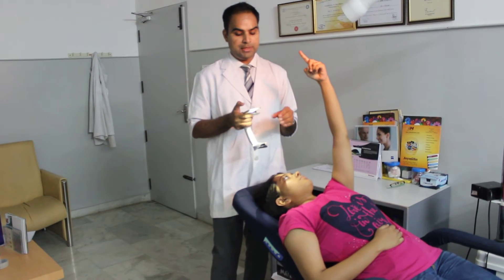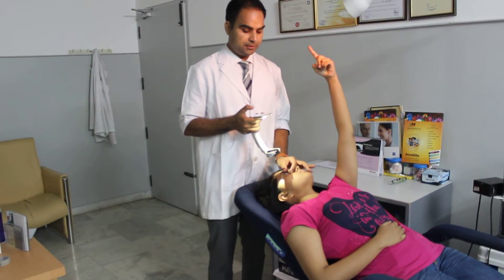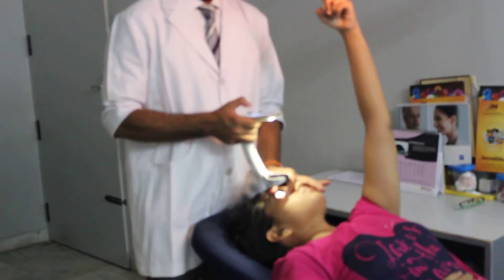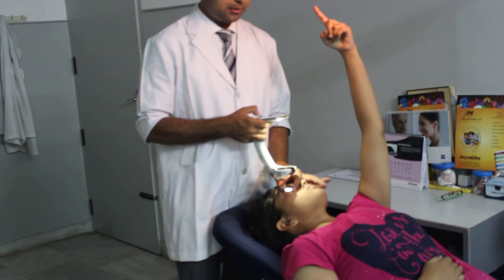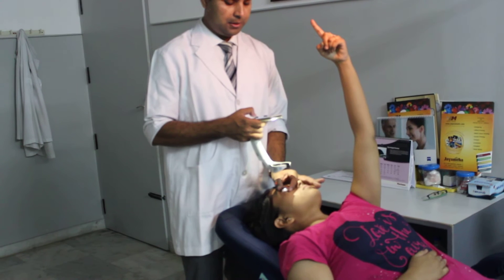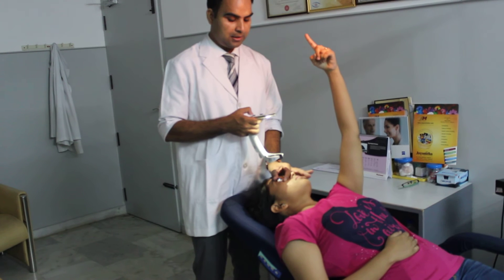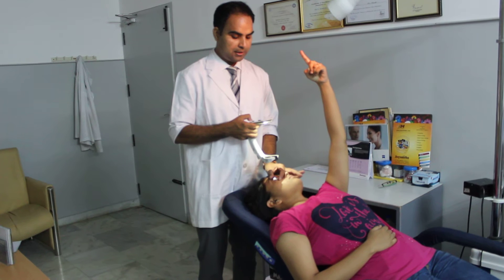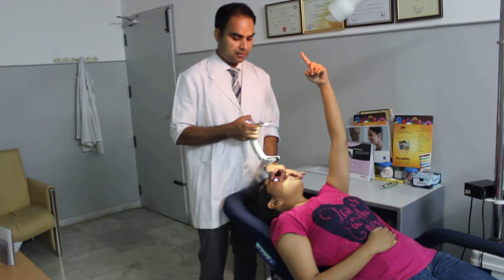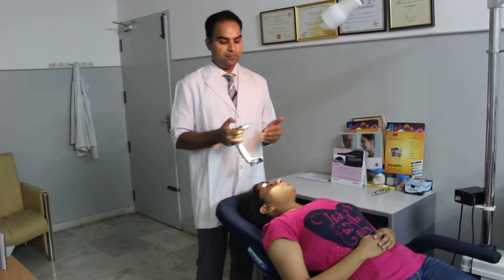The first picture we are going to take is the central fundus. Go close to the eye, and once you see the red reflex in the pupillary area, slowly come up and keep coming up till the entire screen is full of the image, then just hit the capture button. That's the way you take the central fundus.